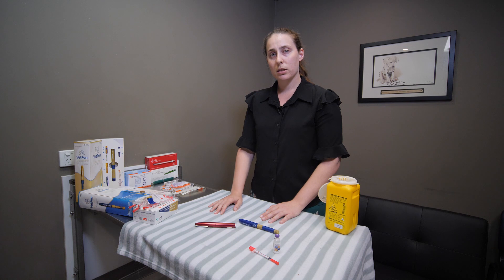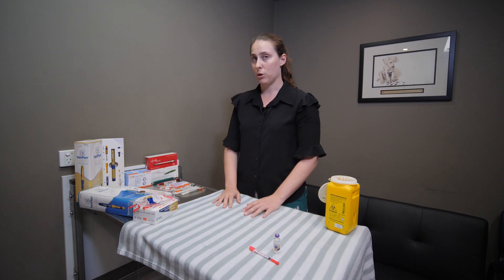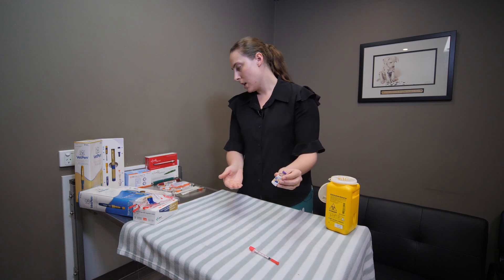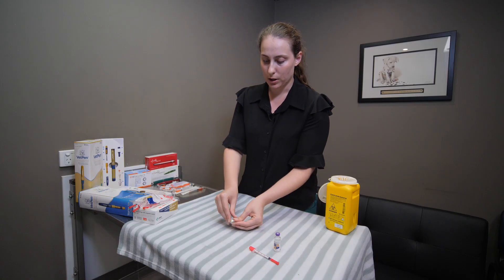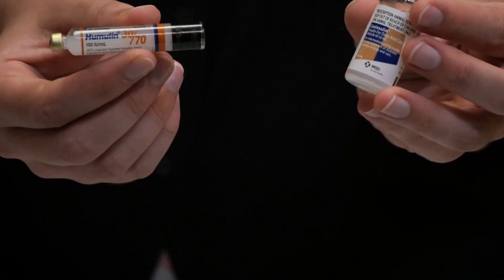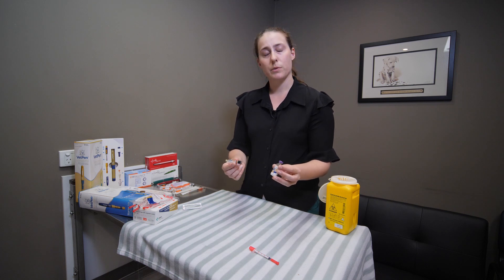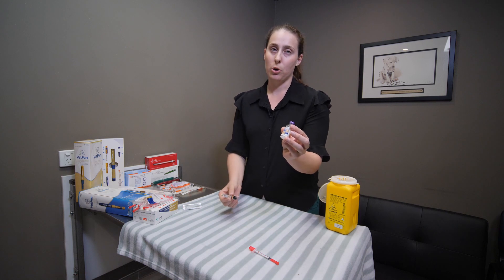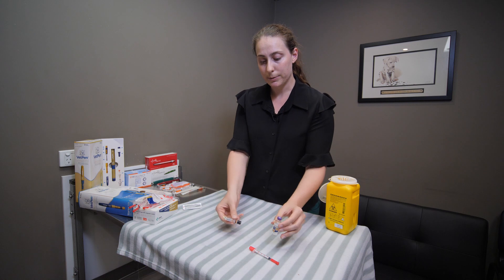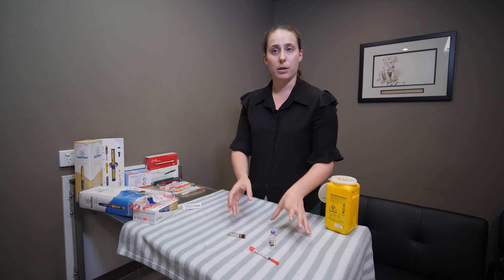There are two main types of insulin that dogs usually receive for diabetes, and depending on which type your pet is on will determine which pen you can use. The most common products we have are Caninsulin and Humulin. Humulin is a human product, and although these two insulins are treated similarly in terms of dosing, they are a different concentration. Caninsulin is 40 units per mL whereas Humulin is 100 units per mL, so drawing up the same volume will give you a different dose between these two products.